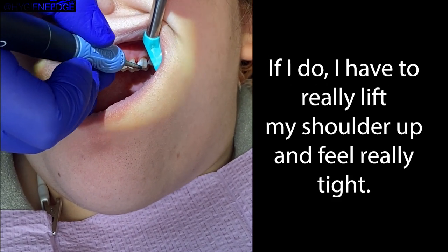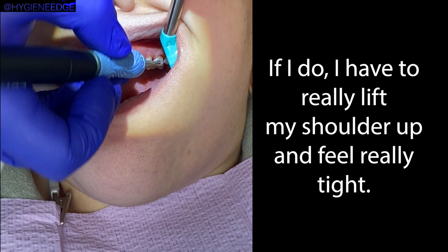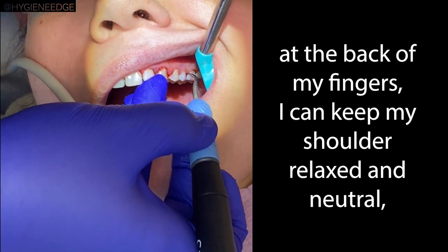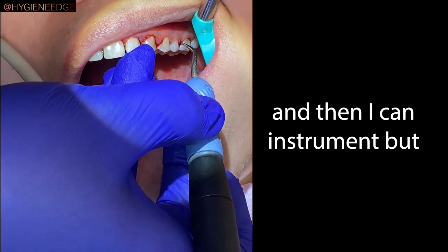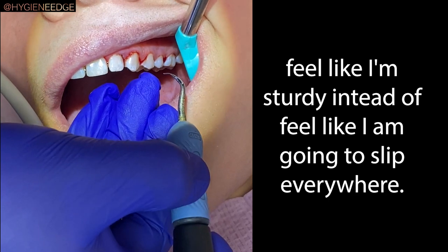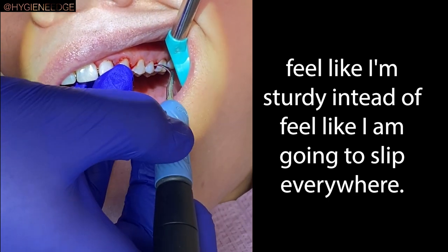Instead of trying to get a fulcrum right here — if I do, I have to really lift my shoulder up and feel really tight — if I fulcrum down here at the back of my fingers, I can keep my shoulder relaxed and neutral, and then I can instrument but feel like I'm sturdy instead of feeling like I'm going to fall all over the place.